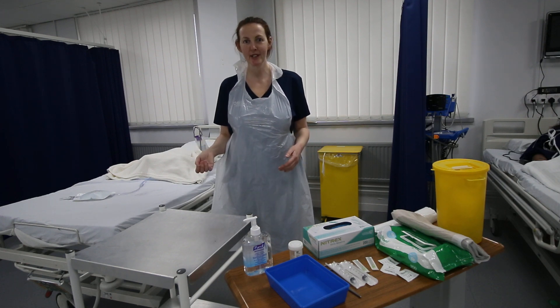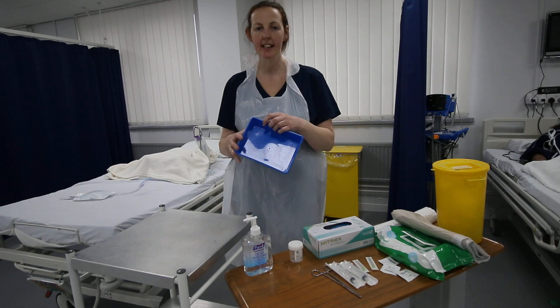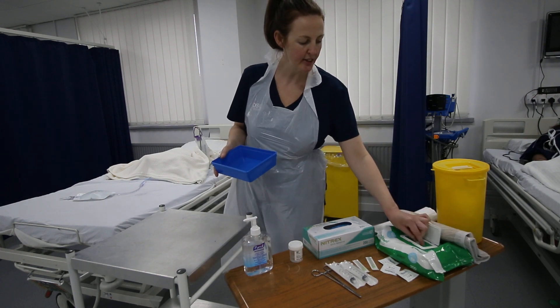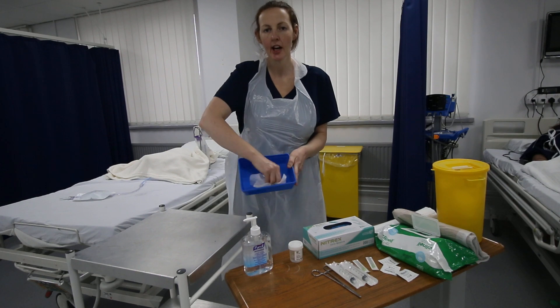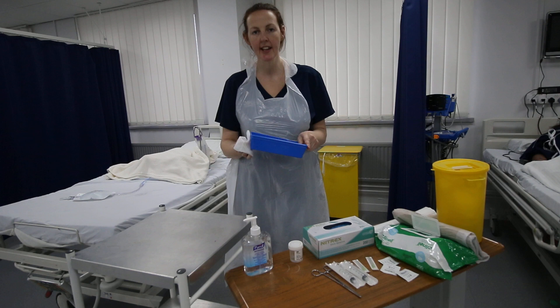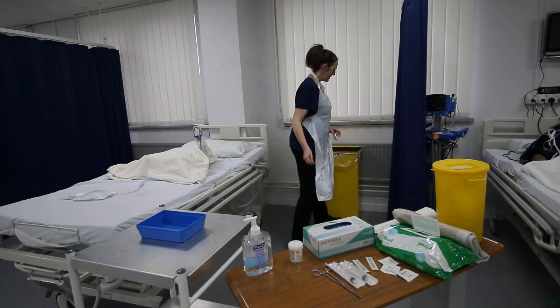We've checked the trolley is clean. I'm now going to check the tray is clean. I'll use the 70% clinell wipe to make sure it's clean — I clean the bottom of the tray, then the outside edges, and then the actual outside of the tray. I'll let that air dry for 30 seconds and dispose of this in the clinical waste.